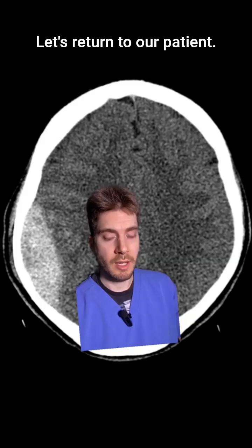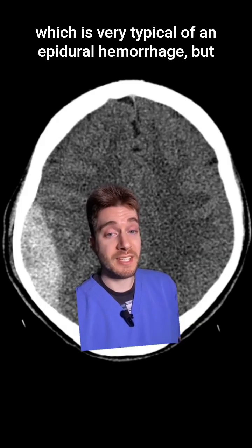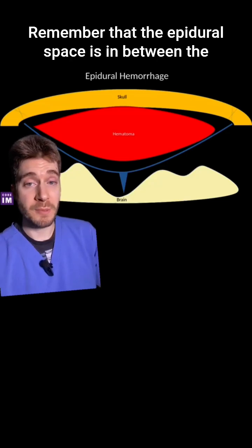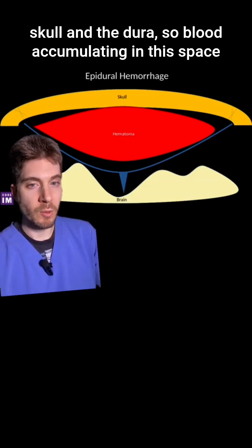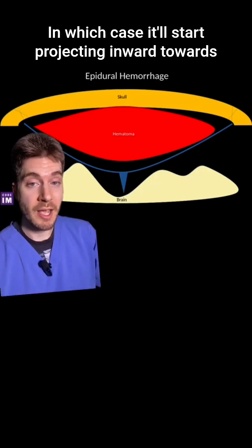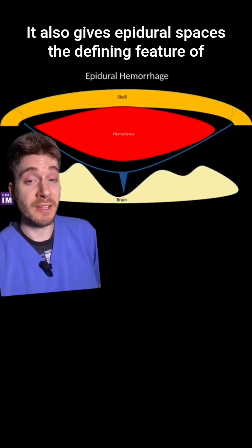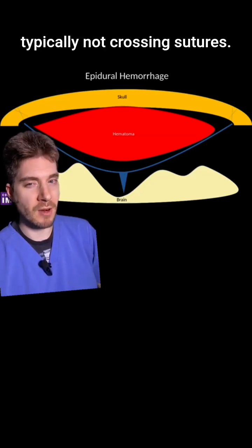Let's return to our patient. Notice how the hemorrhage has this lens shape, which is very typical of an epidural hemorrhage. The epidural space is in between the skull and the dura, so blood accumulating in this space will spread freely until it hits one of these sutural lines, at which point it will start projecting inward towards the brain parenchyma, giving it this lens shape. This also gives epidural hematomas the defining feature of typically not crossing sutures.